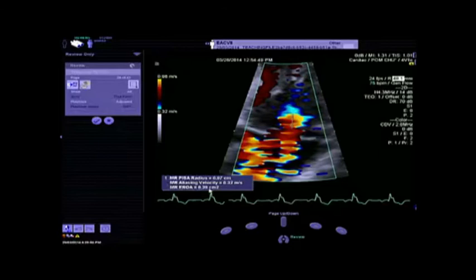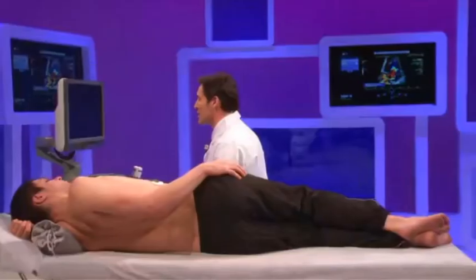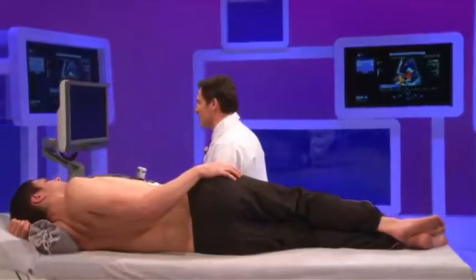But in mitral regurg, and in primary, we can use two different cutoffs in the moderate part, the mild to moderate and the moderate to severe. And in these patients, we have moderate to severe mitral regurgitation. So now, what are the next steps that we could do in the patients with a mitral regurgitation to assess again the severity of the mitral regurgitation?